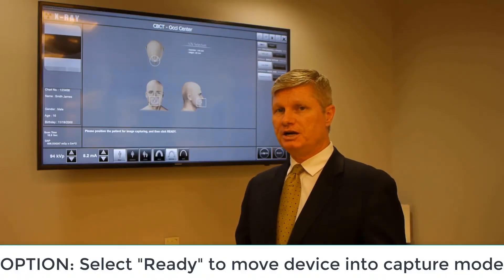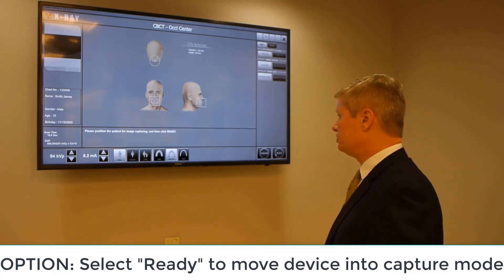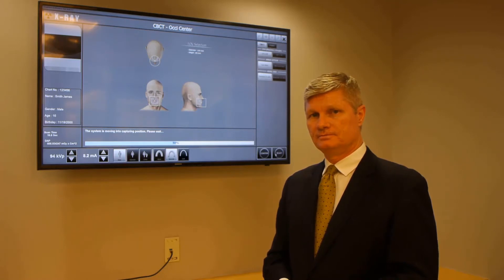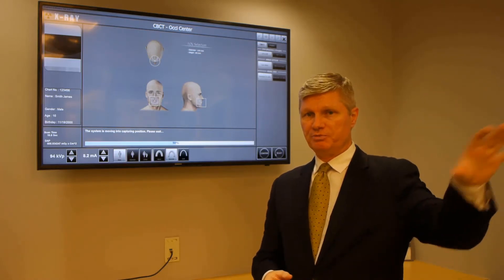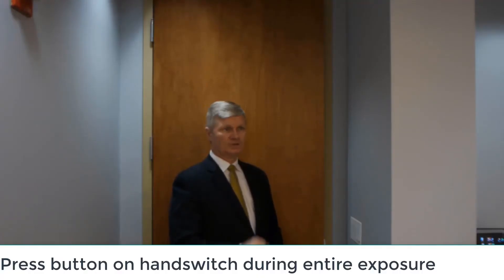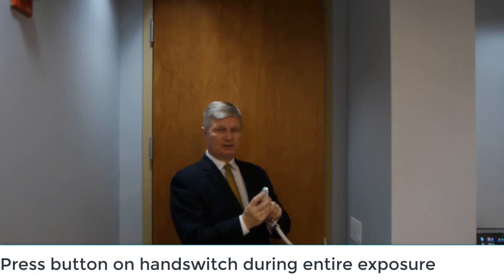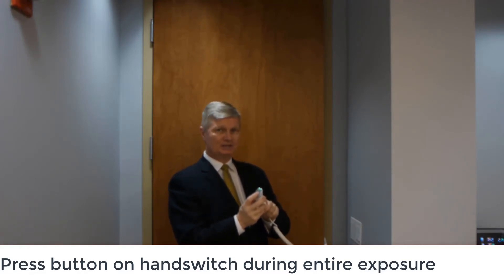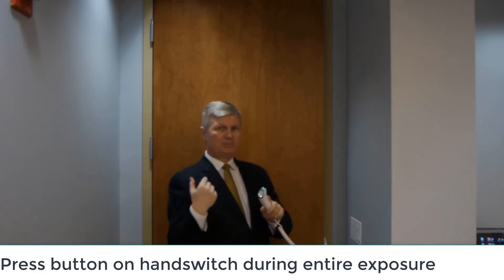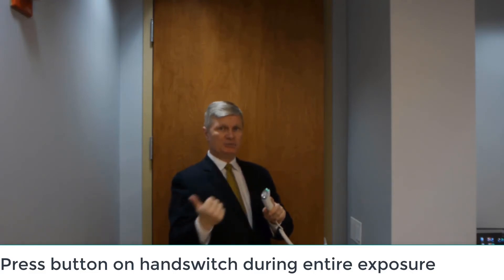You can click the Ready button either on the device itself or on the capture software down below. By doing that, we put the device into capture mode. The system is moving into capturing position — please wait. When the device has rotated to capture position, provide instructions to the patient and then click the button to capture our image. After providing instructions, the green light will be on and ready to capture. Press down on the button with equal pressure the entire time for 18 seconds. When the light is illuminating in orange, the device is capturing the image and rotating around the patient. When the orange light turns off or the green light turns back on, you can release the hand switch — image capture is completed.